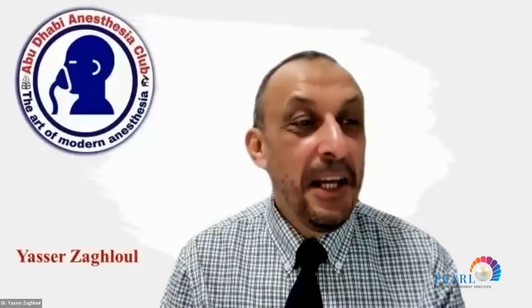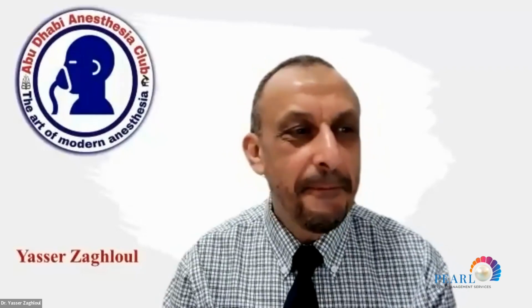All right. Another comment from Dr. Ahmed. He is talking about ultrasound in difficult airway. There is no textbook that mentions that, and I remember you mentioned a reference from 2022, that the prediction of difficult airway by ultrasound is not established yet. So what is your comment?